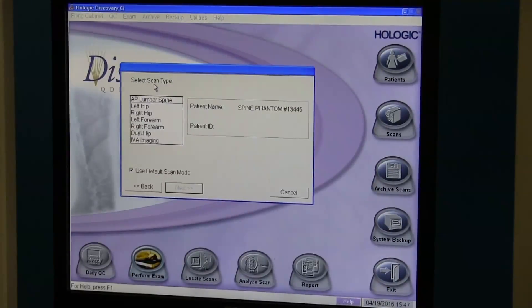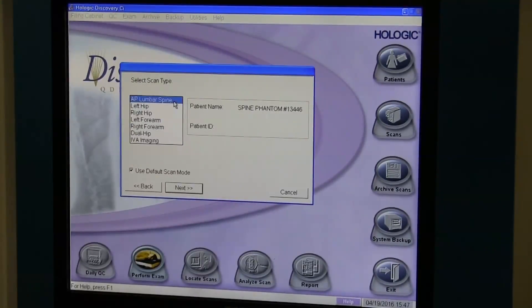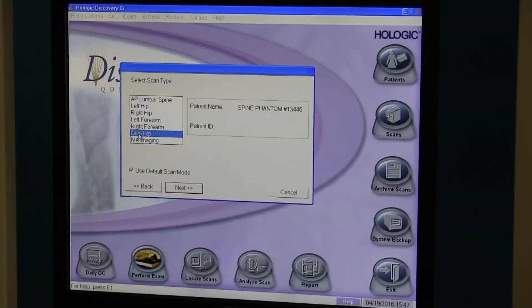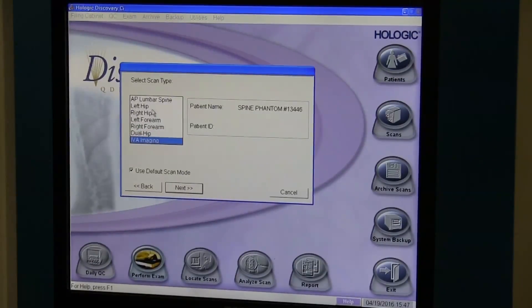Now we need to select our scan type or protocol: the AP lumbar spine, the left hip, right hip, left forearm, right forearm, dual hip, or IVA imaging. Some systems may have more options depending on the model of the system.